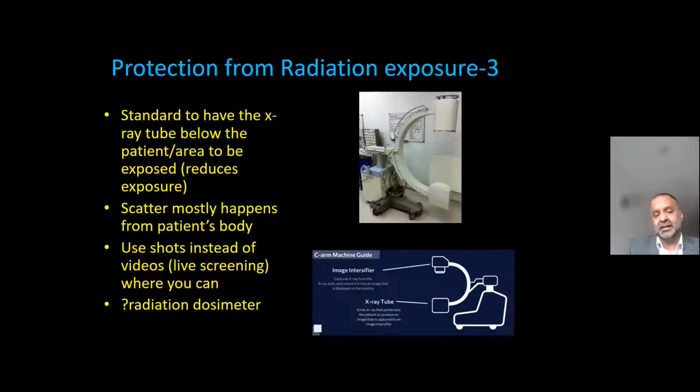Now, there are radiation dosimeters, and some trusts regularly use them. You must have seen your radiographers wearing these in Pakistan. I have certainly seen that in military hospitals in Pakistan, and the people tell me that they hardly ever become positive. But now the modern dosimeters are quite clever, and they can be connected to a computer where the amount of radiation that you're exposed to can be calculated. And if you need a break from your professional duties, that can be done as well.